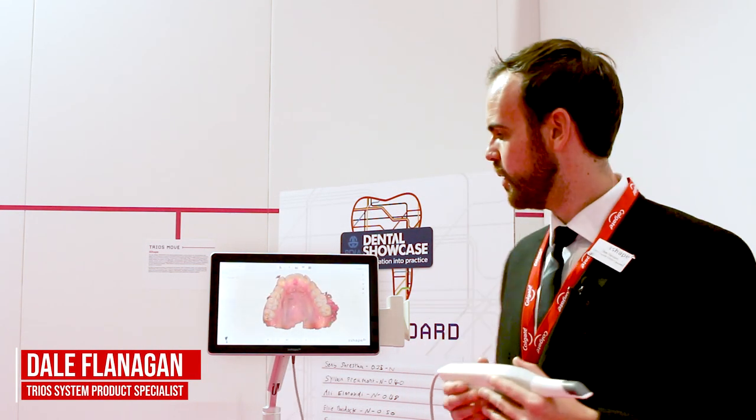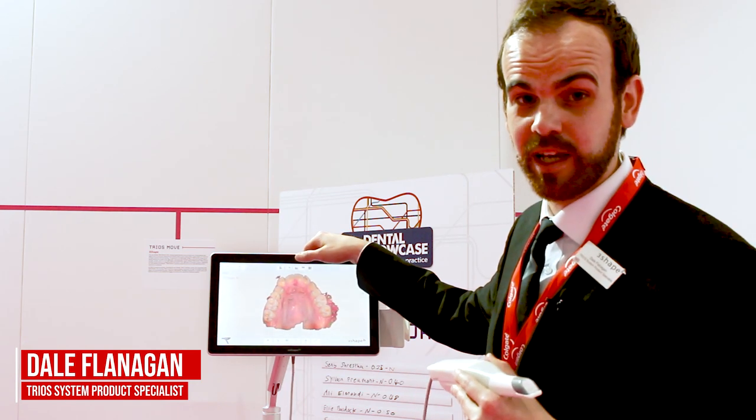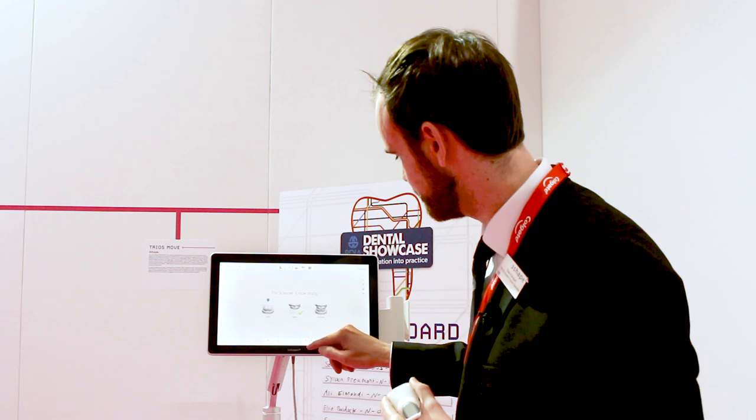Introducing the three-shape Trios. Here is the move — allow me to demonstrate and do a demo scan for you. We'll start off by scanning the lower.